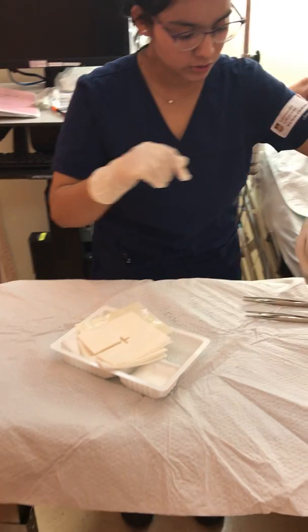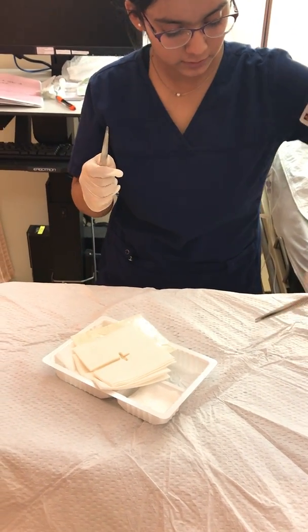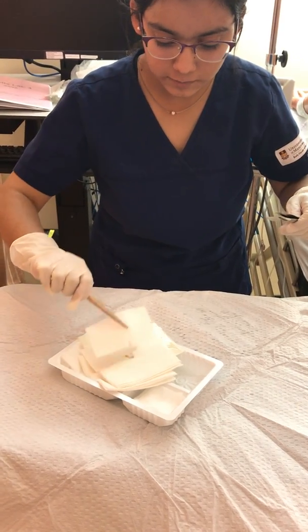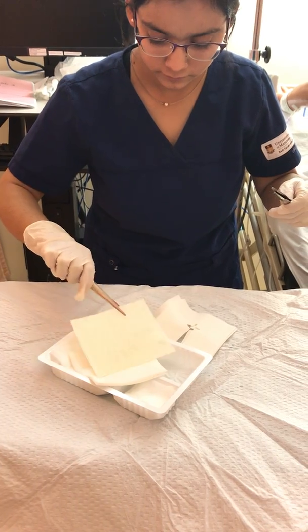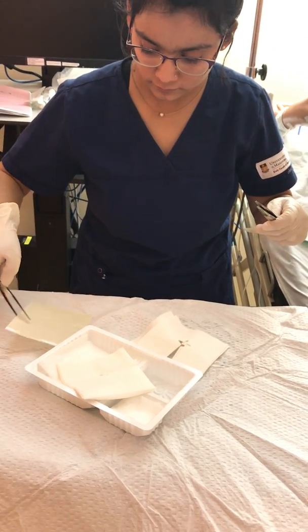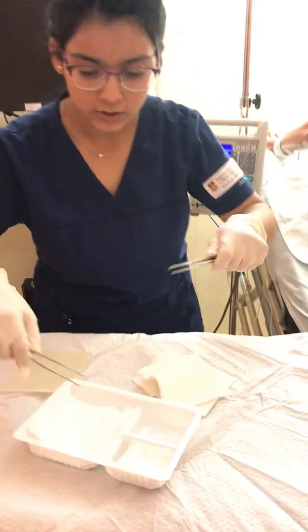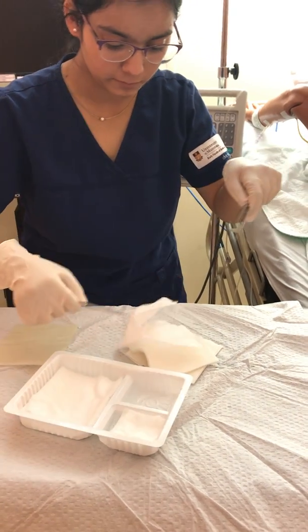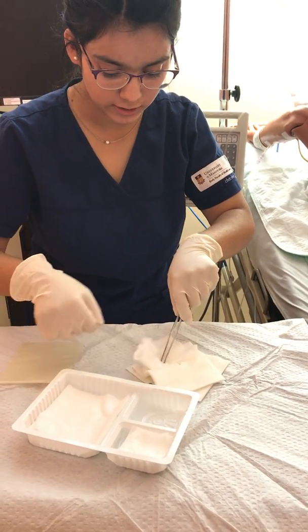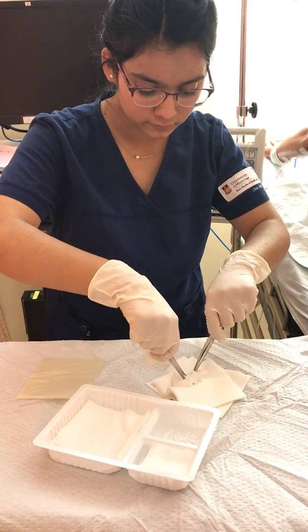So now that I have my gloves on, I'm going to get my drain. Again, be aware of how I'm holding my forceps. I have my tray. So now we're going to put these right here because it's still within our sterile field. Some hand hygiene. I'm going to put this over here. And I'm going to put the second one in another direction. So now I'm just going to use these because I'm going to be covering a little bit bigger area. So we're going to make a rosette out of them, 4x4s on top, so that when I put the dressing, I'm going to tug on the skin.